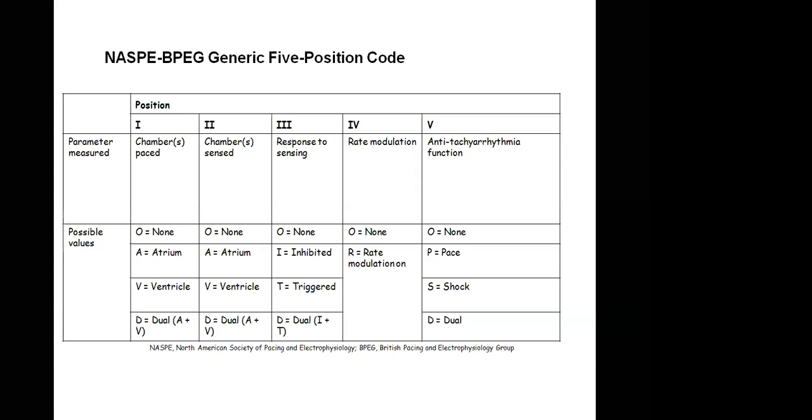Now, I'm sure what should be in your mind is, why should you do that? You'll be asking yourself, why should I be pacing when there's normal intrinsic activity? Dr. Julius, I'm sure that should be a question in your mind. This patient has normal intrinsic activity, so why should the pacemaker pace on top of it? You'd say that's a stupid setting, right? So we give you clinical indications where you do it.